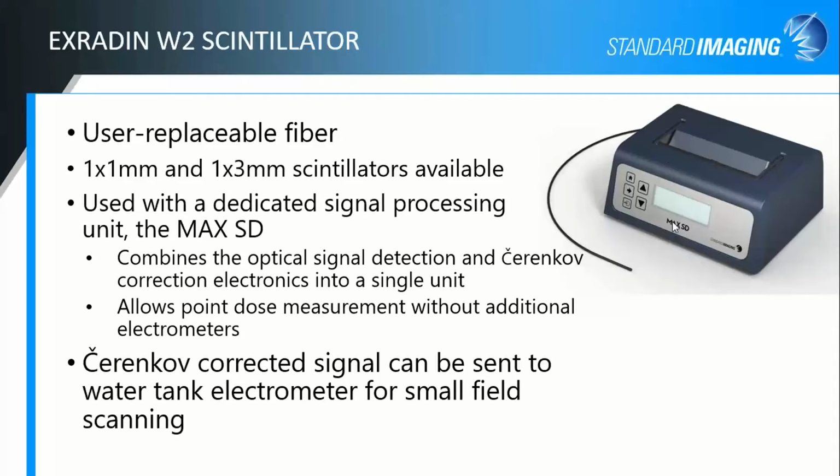The Max SD basically acts as a pass-through then. I should start with, it works fine as a standalone. It is designed so that you can do your characterization measurements for your CLR, you can do your dose calibration, it will store those values just fine. You can do point measurements with the system directly. We have a web page interface, you can run it from outside the room, you can zero it, you can collect all your measurements and then export it as a CSV if you want, or copy it into your Excel spreadsheet to have all your data available right there on the screen in front of you. So it works just fine as a standalone for those point measurements.